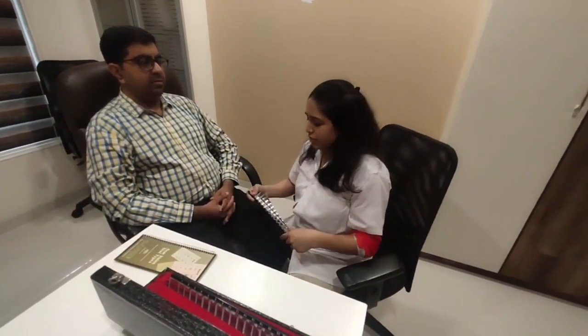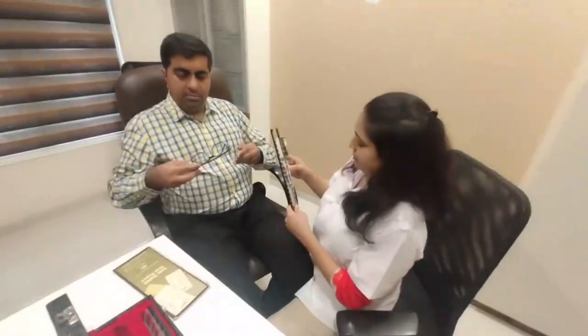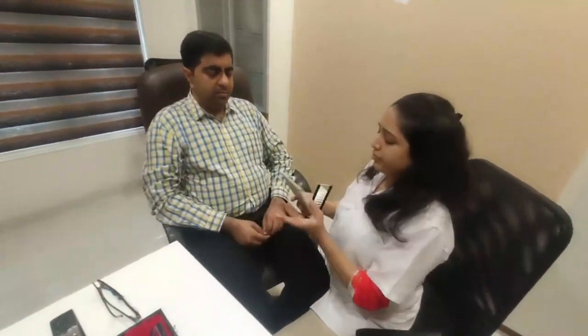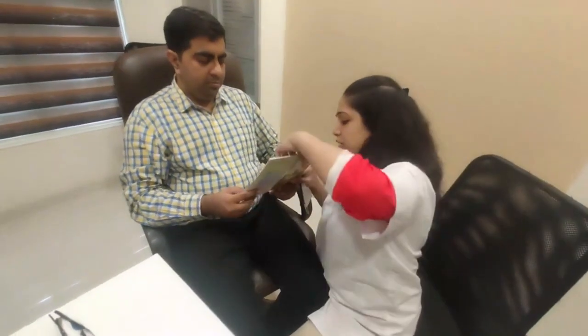Along with that, we need to recheck his refraction just to make sure that the refractive error is properly in place. Let's do an AC by A ratio now. Since the patient is already wearing glasses, we will use those glasses to measure the AC by A ratio. First, we will do the prism measurement without the glasses and then with the glasses. Remove your glasses, please. Hold this in your hand. Can you see this word?